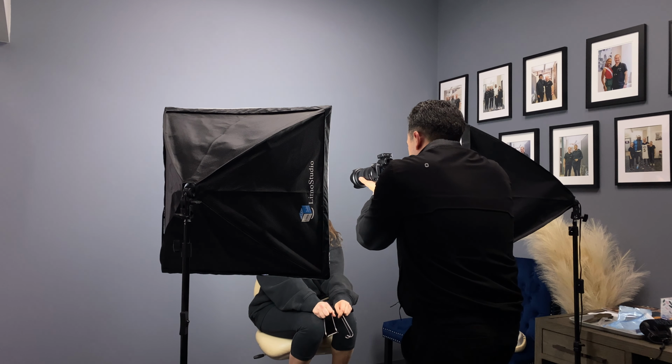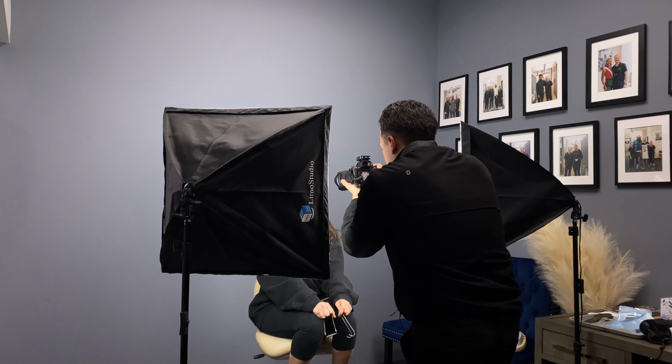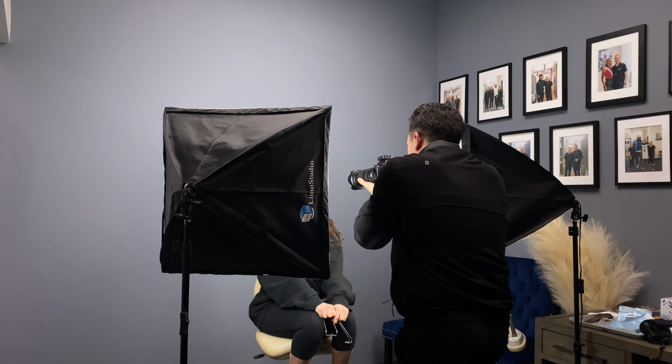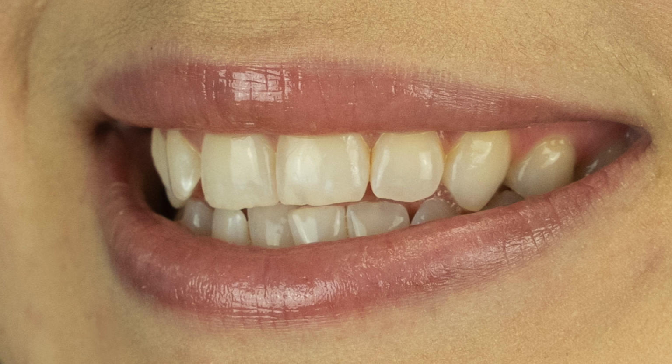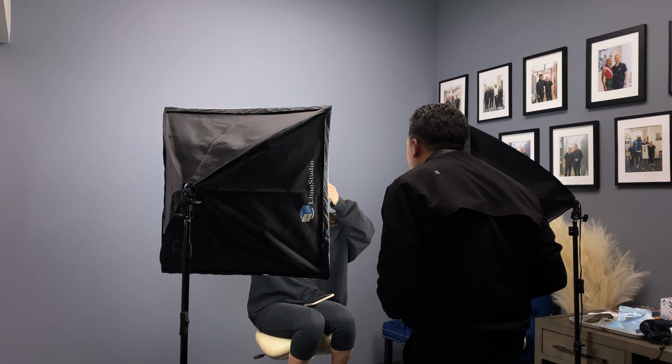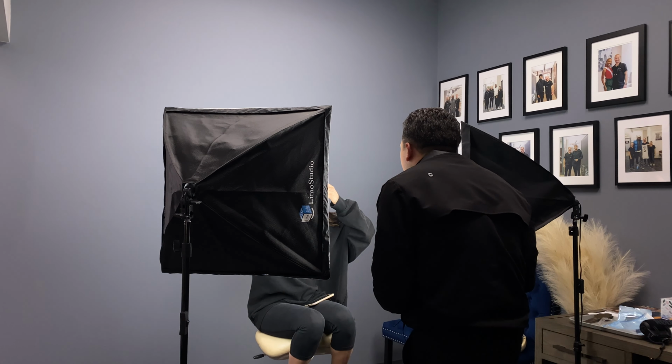And they're basically just a sequence of shots, a certain sequence that I use every single time for beginning and final photos for somebody doing veneers. This person happens to be a Smile giveaway winner, and we kind of talked a little bit. Usually these photos go a little bit quicker.